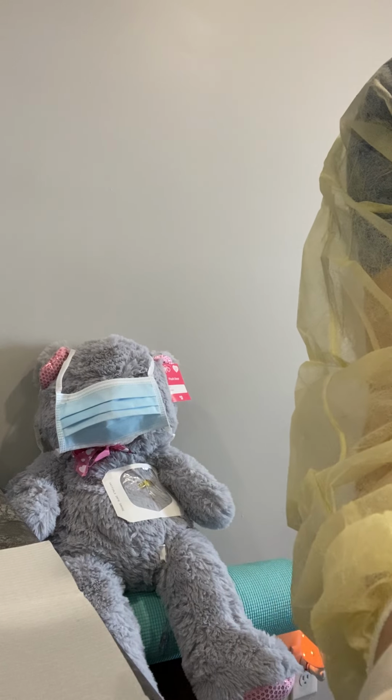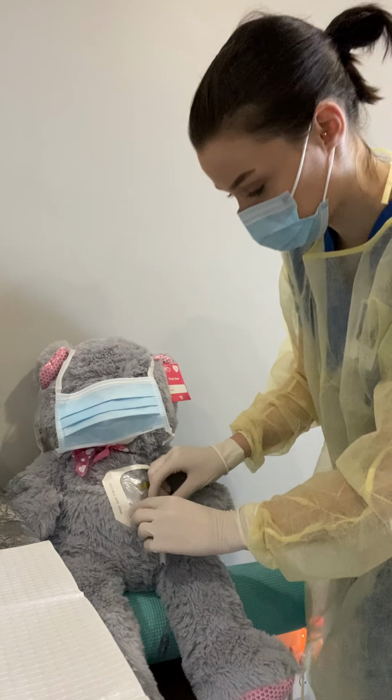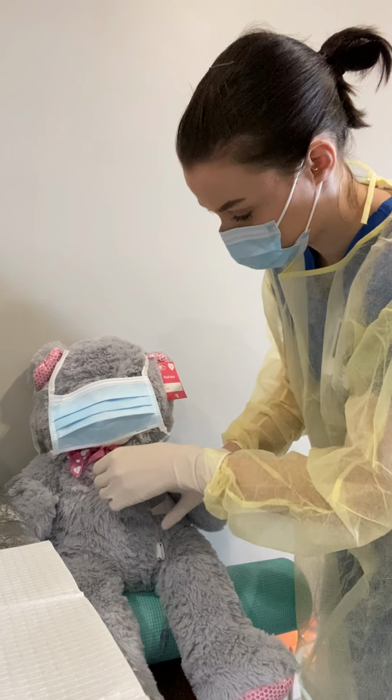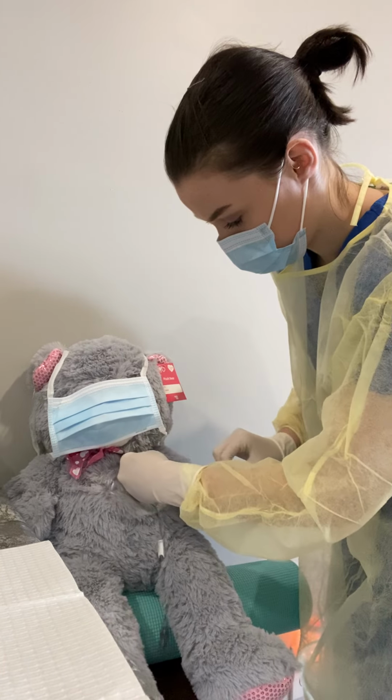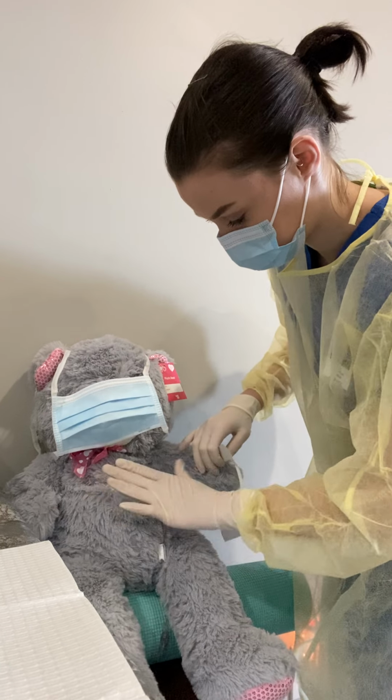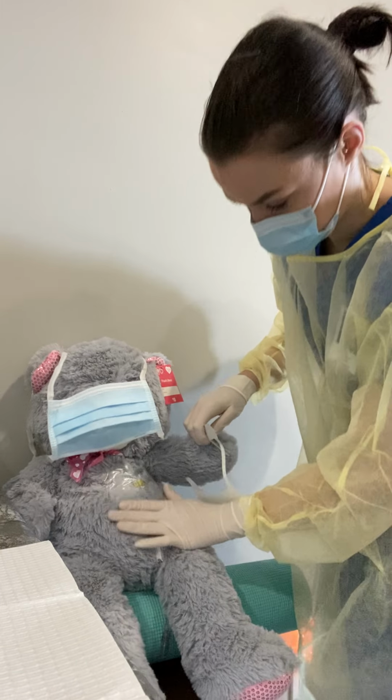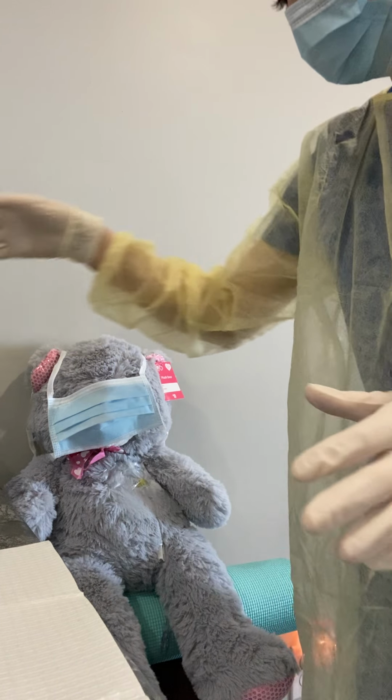Let's see if I can get you guys closer. Okay, so I've got this all done. Pull this off. I'm going to initial, date, and time that. Okay, discard.